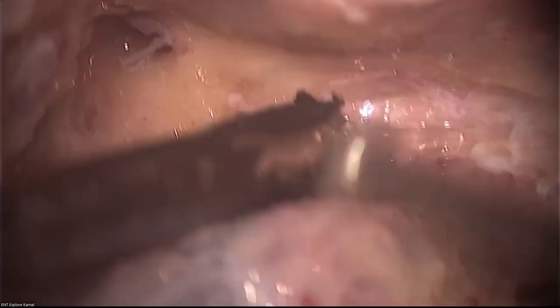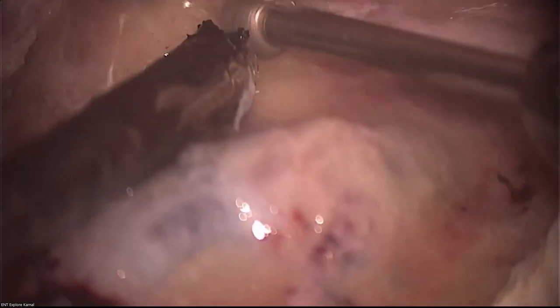Now, this chorda is a great landmark to protect the annulus. That's why the chorda is considered so. See this chorda?